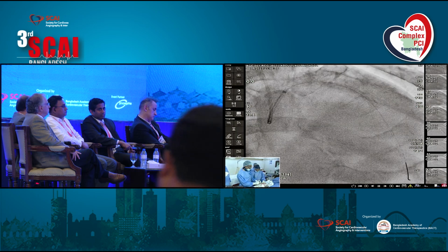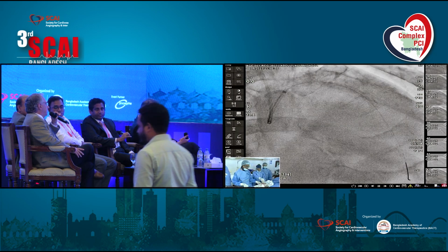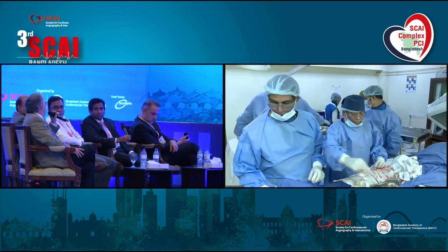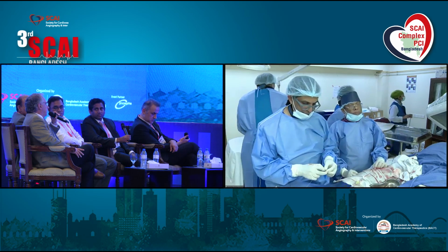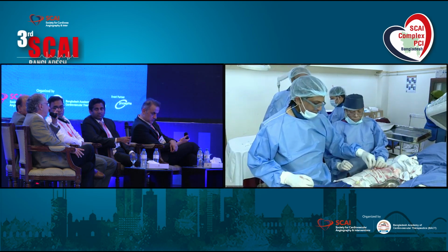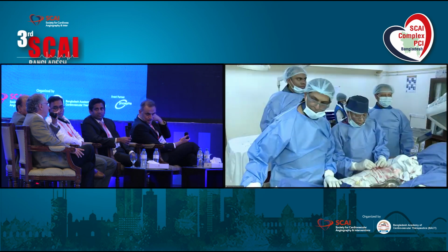Louis, what do you do? So I think this is an important question, because many times the patient has a positive remodeling. So when you go from EEM to EEM, you may be measuring an area of the artery that has positive remodeling. So I try to use media to media as well as I can, or lumen.